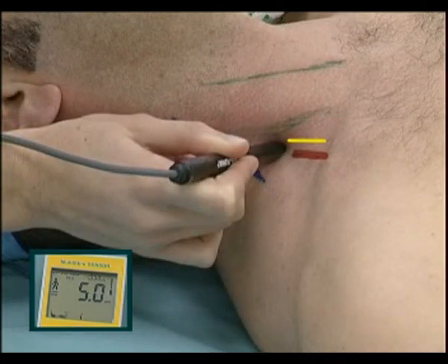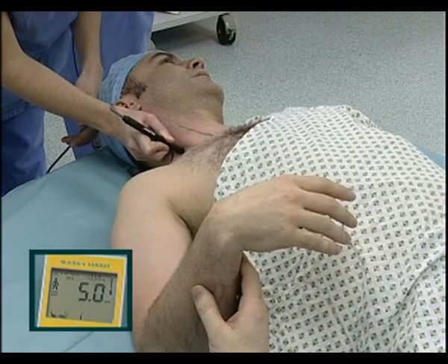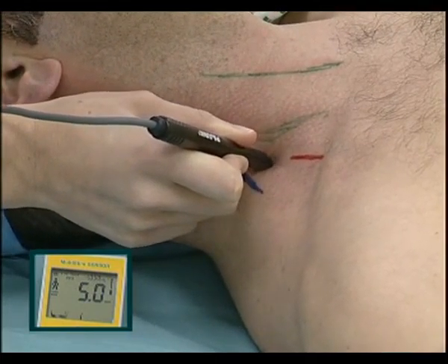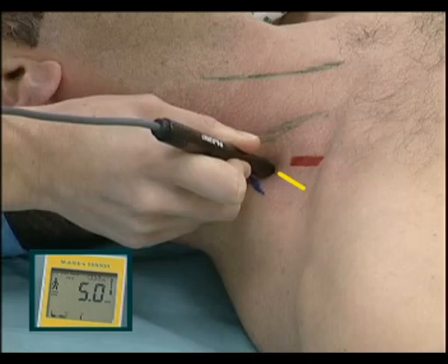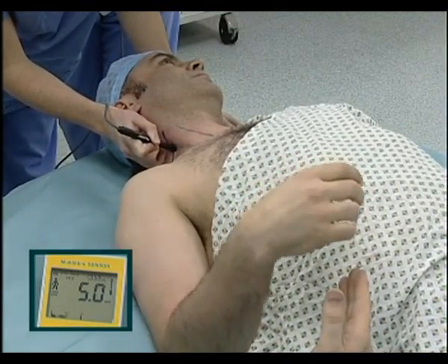Next, we stimulate the phrenic nerve, which is anterior to the brachial plexus. We can see diaphragmatic contraction. Moving laterally into the interscalene groove, we stimulate the brachial plexus, and one can see elbow flexion as the musculocutaneous nerve is stimulated.